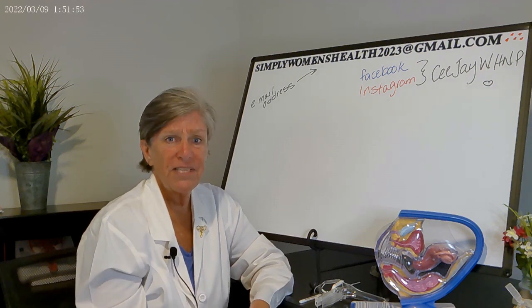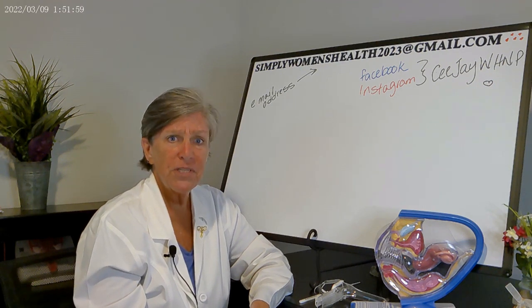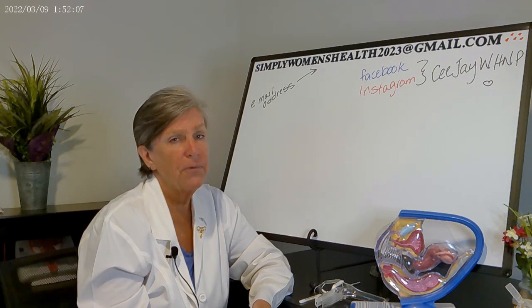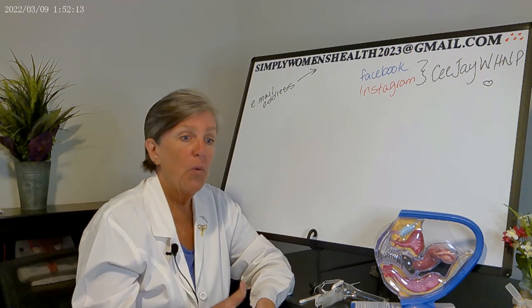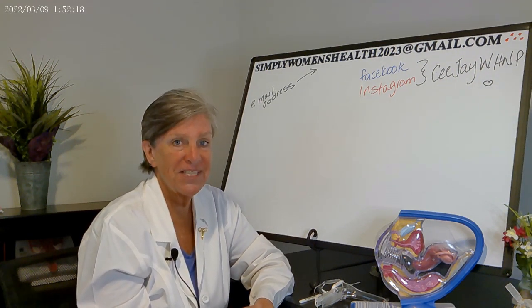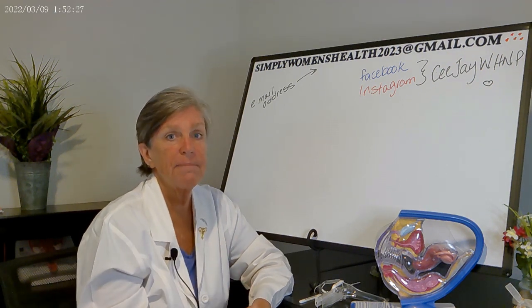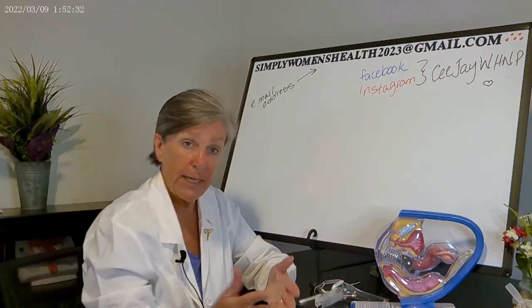So you and your provider have decided that the hormonal IUD is the best option for you. They're probably going to instruct you to not have unprotected sex for 2 weeks prior to the IUD insertion. I usually encourage my patients to take some kind of a pain reliever, whatever they use for cramping, an hour before their appointment time. When you get to the clinic, they are going to want to do a pregnancy test. We have to make sure you're not pregnant before we put this device in. Your provider is going to sit down. They're going to go over the risks and the benefits, and they'll probably have you sign a consent before we put the IUD in. Then you're going to get on the table.